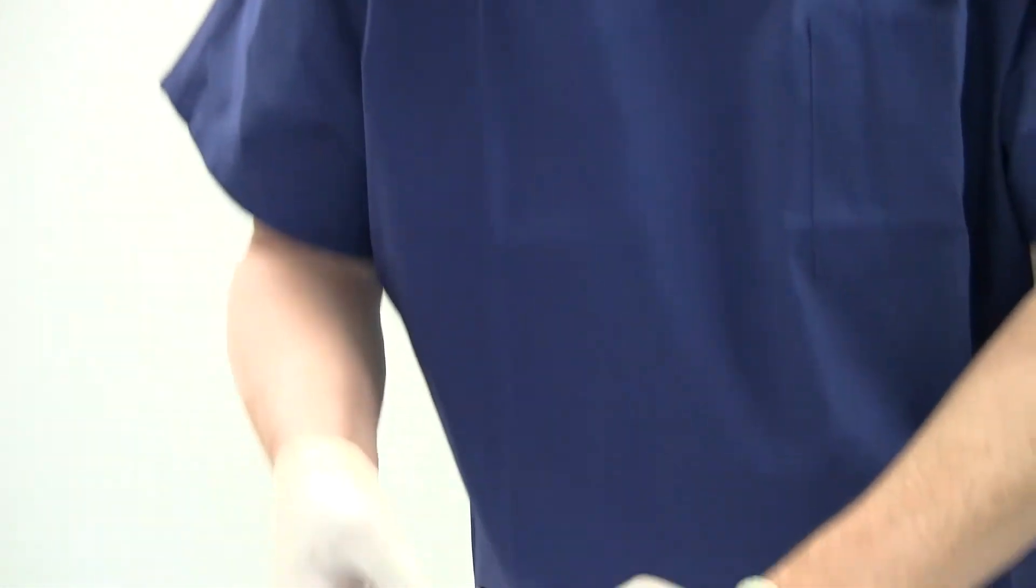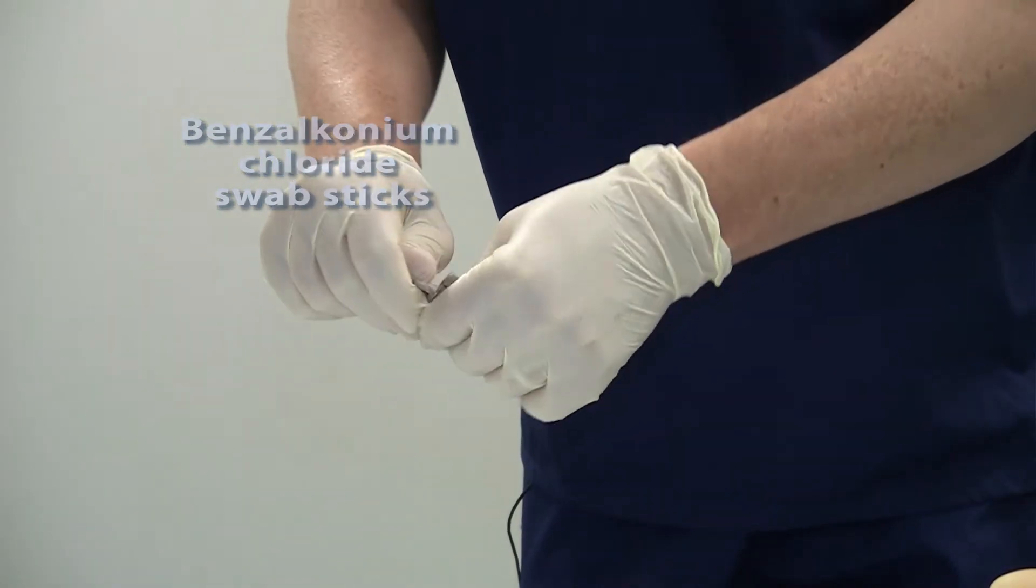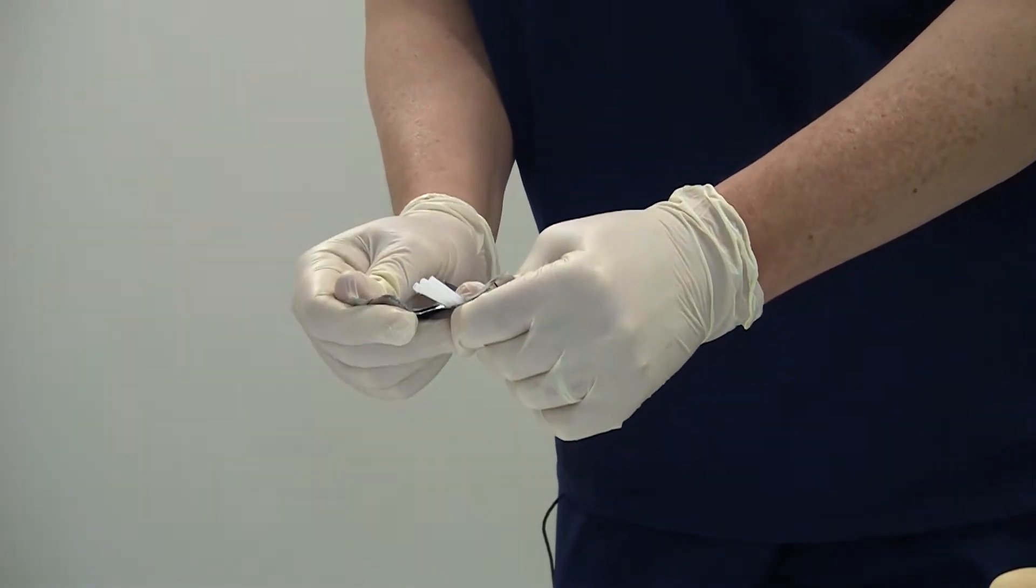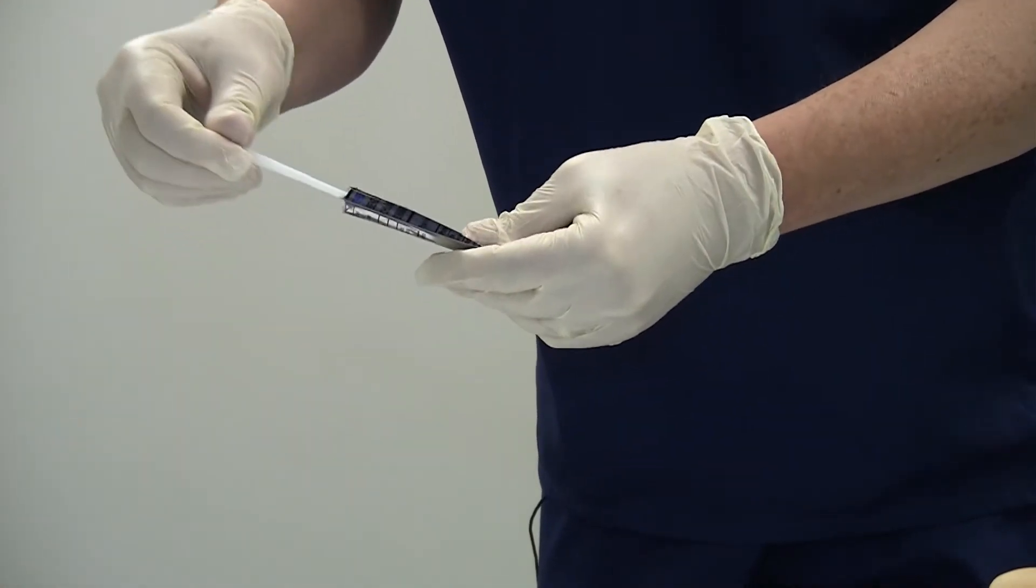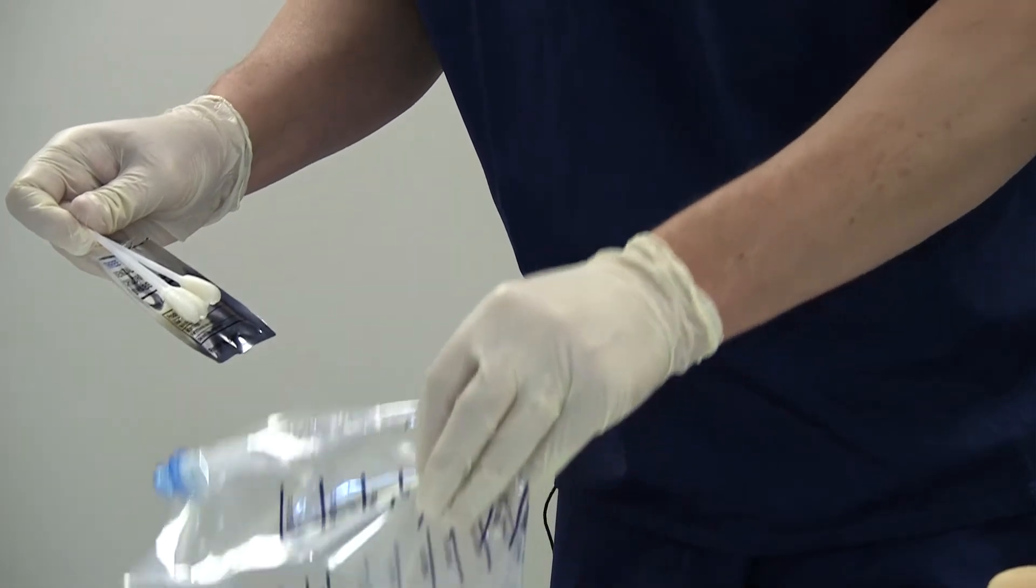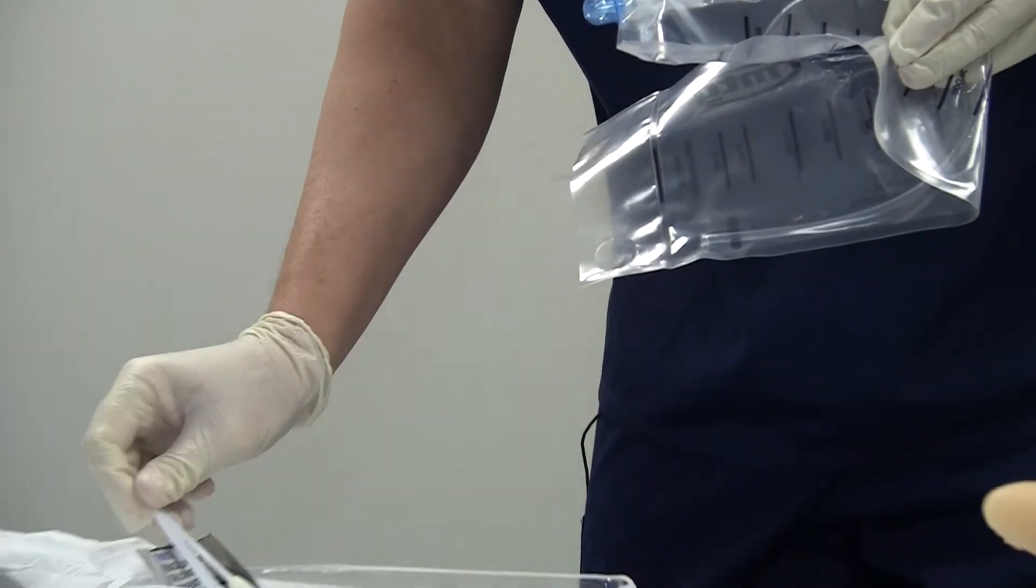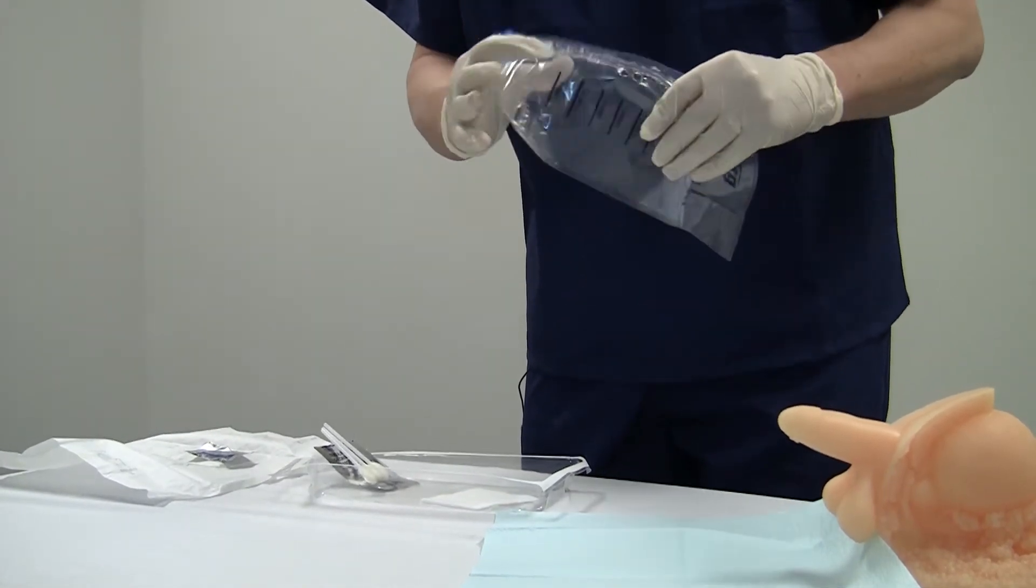The next kit component after we've placed the underpad are the benzalkonium chloride swab sticks. There's three of them in here. These are our antiseptic. Tear the top of the package off and remove the three swab sticks. I like to take them entirely out of the pack and set the pack right back in my sterile field. At the same time, I take the catheter with my other hand and remove it from the kit.